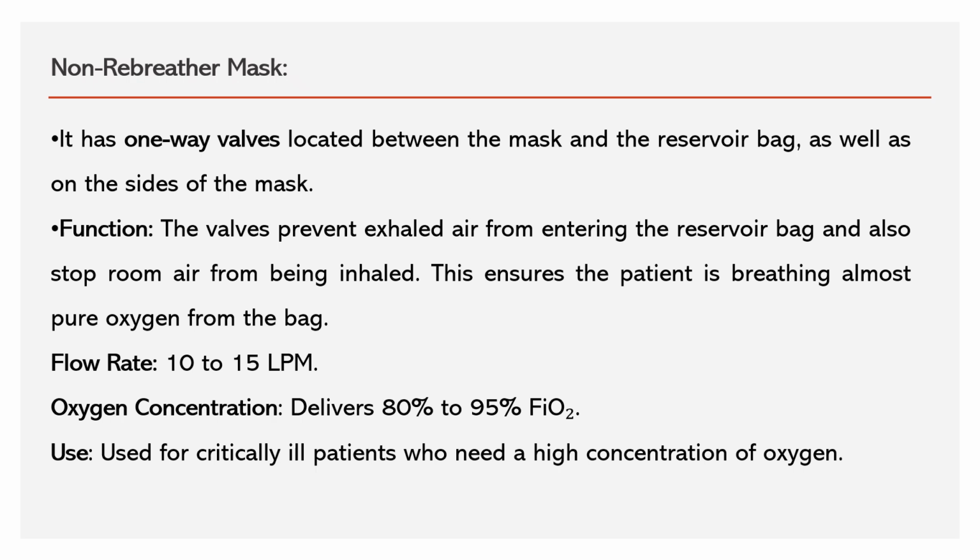In the partial rebreathe mask, we have seen already that it is mixing when the patient is inhaling and exhaling. But here in the non-rebreathe mask, that mixing is not happening. This ensures the patient is breathing almost pure oxygen from the reservoir bag.